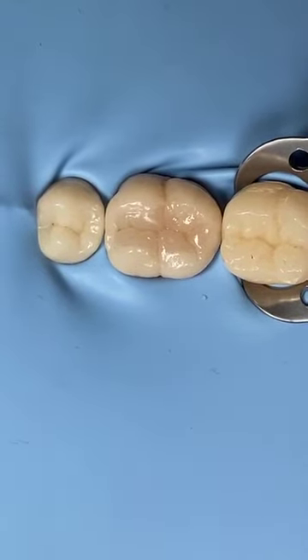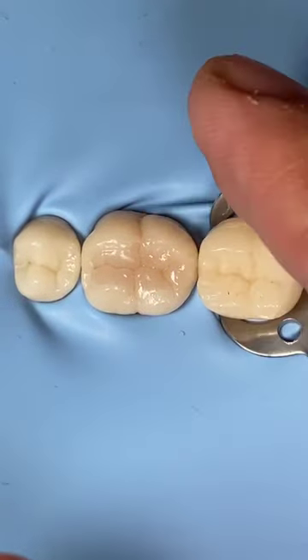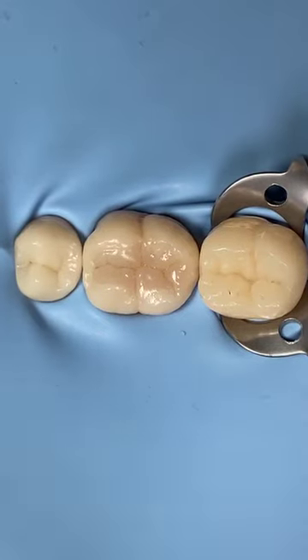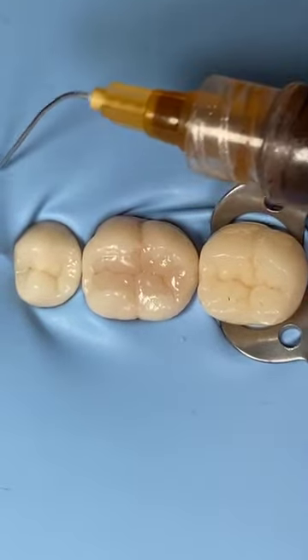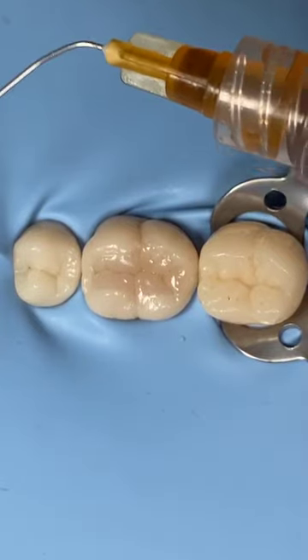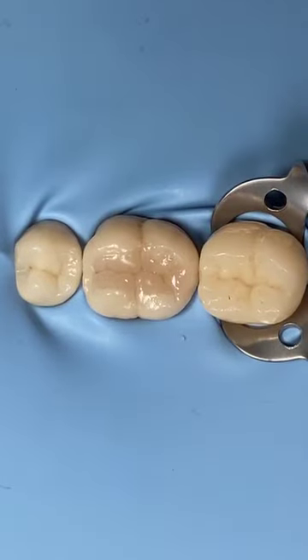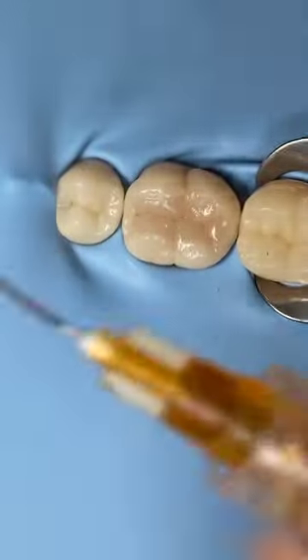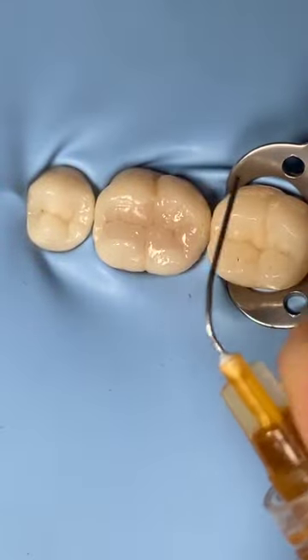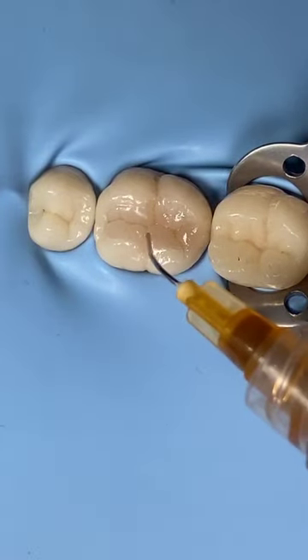Because I don't have a micromotor here, just pretend that the tooth is already polished, already flat, already smooth, and then put a stain. So where's my stain? This is my low viscosity stain from Coltene. If you have it in your clinic, it comes with the tube, just like your modeling resin here. But I want it to be in the syringe, so I move the liquid into the syringe just like this, and then I change the tip with the etching tips, so you can easily put that stain material on top of that restoration.